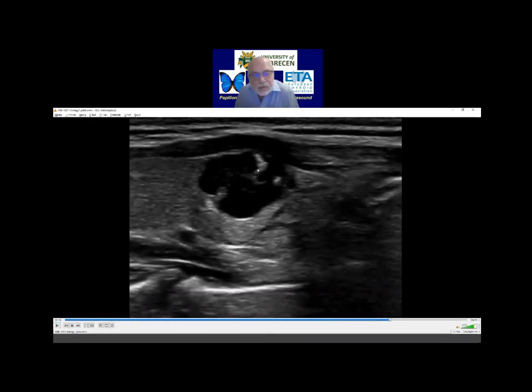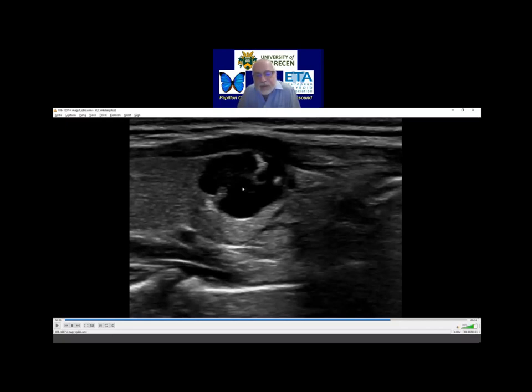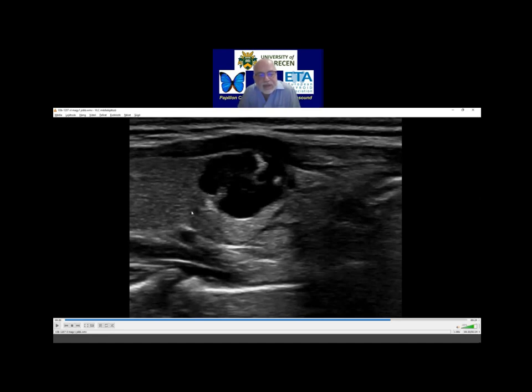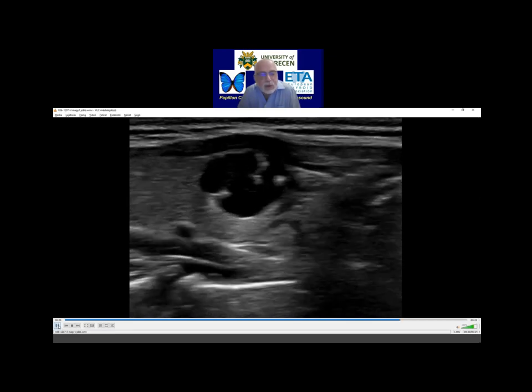One thing: this quite hyperechoic solid part — the hyperechogenicity is caused partly by the presence of cystic fluid. This is the augmentation of the ultrasound wave dorsal to the cystic parts. Here you can see another part of the solid portion. This is quite far from the cystic area and is much darker than the part which is clearly very close to the cystic part.